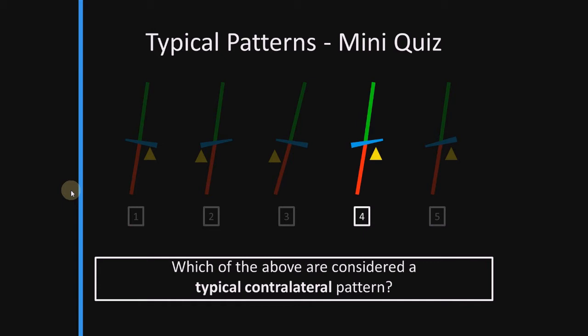When we look at our number 1 example, you can see that the wedge stick figure of the atlas frontal plane line is larger on the right-hand side, thus showing a posteriorly misaligned atlas on the side of the ACD. With the C2 spinous rotated towards the ACD, this would indicate a counter-rotation misalignment of C1 and C2, which is not typical to the contralateral pattern. In the second example, the C2 spinous is rotating into the closed C1-C2 joint, which is atypical.